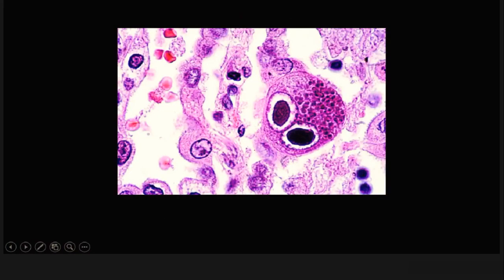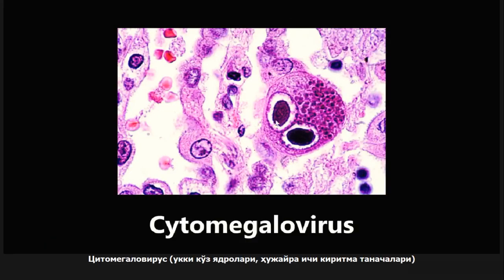This next one is an example of cytomegalovirus. What we're looking at here are these owl eye nuclei within the cell — these are intranuclear inclusion bodies. When you see this, you want to start thinking about cytomegalovirus. There's so much to talk about with CMV, but the key histological finding is the owl eye nuclei.